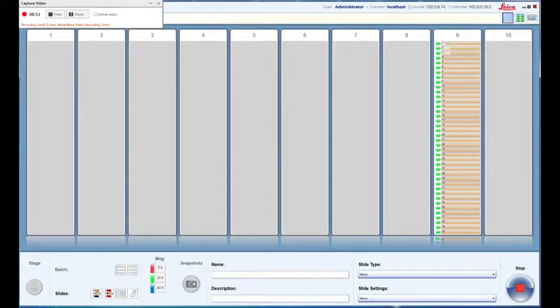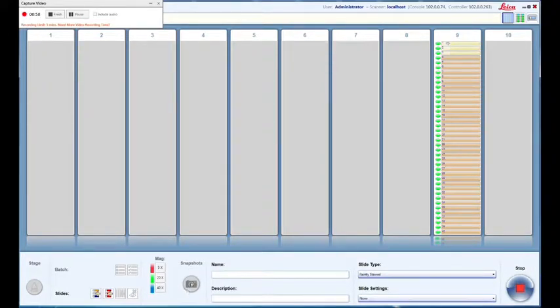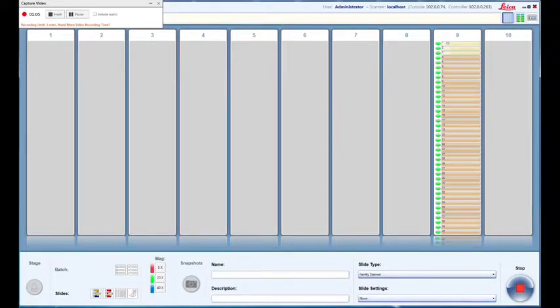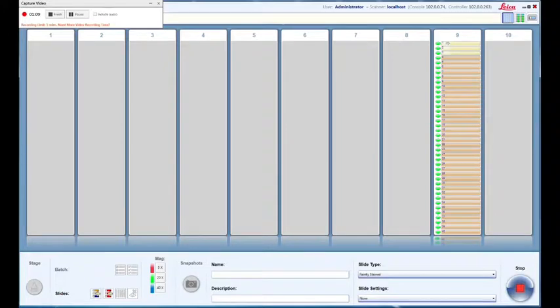Now I'm going to take a low resolution snapshot. You click the little camera button at the bottom and it should begin to take snapshots. As it takes the snapshots, the slide color will change from that yellow to a light blue, as shown right there.